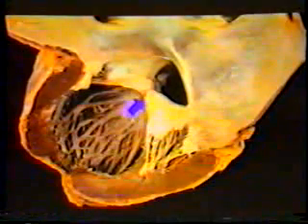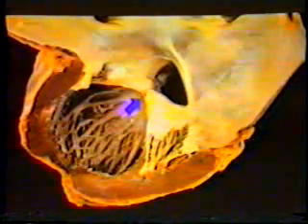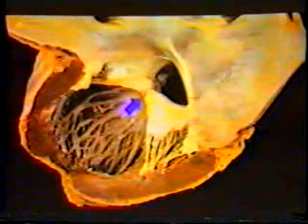Pay attention to the mitral valve. Note the anterior leaflet of mitral valve has a large cleft extending all the way to the base. The cleft in the anterior mitral leaflet is almost always present in patients with ostium primum atrial septal defect and is part and parcel of partial atrioventricular canal defect.